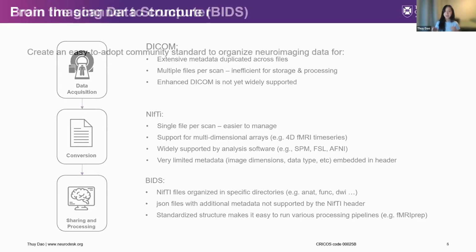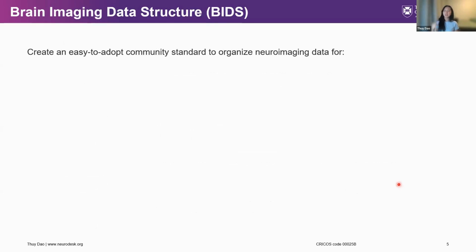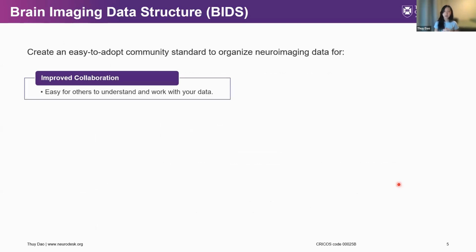And besides the benefit of storing more metadata, BIDS can bring more to the table to make your work more efficient and impactful, like improving your collaboration by simplifying how data is shared and organized with others. It would help them to work with your data set quicker and understand how it's structured and the content in the data set.